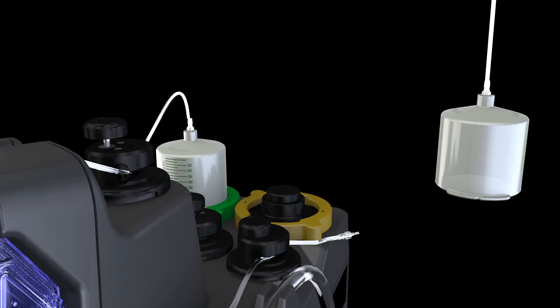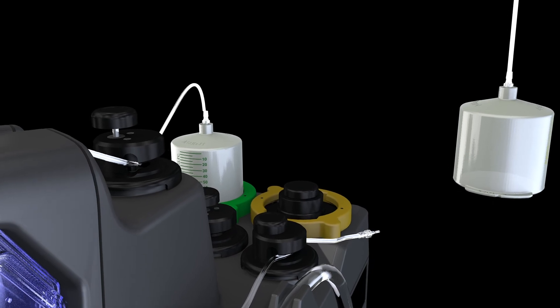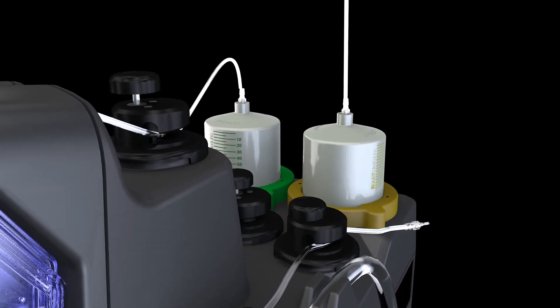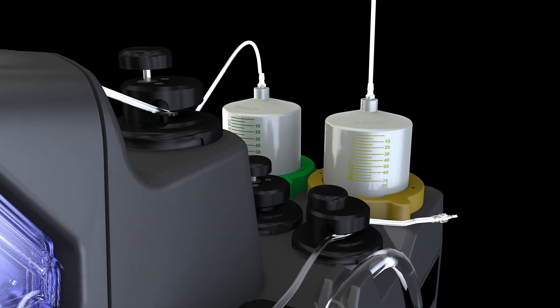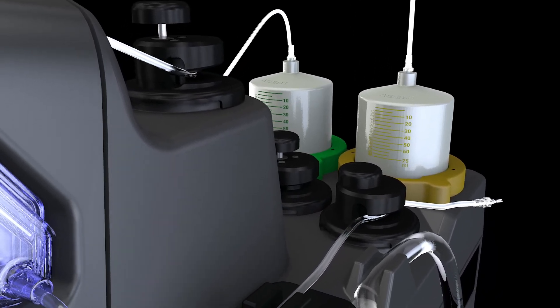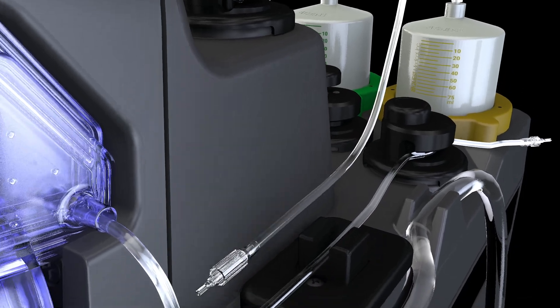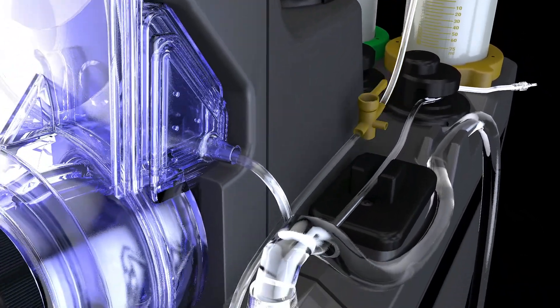Align arrest cartridge into yellow arrest key and turn clockwise until the cartridge clicks into place. Yellow milliliter markers should be front facing. Pick up the other end of the arrest delivery line and attach to the check valve fitting at the lower right port of the heat exchanger.